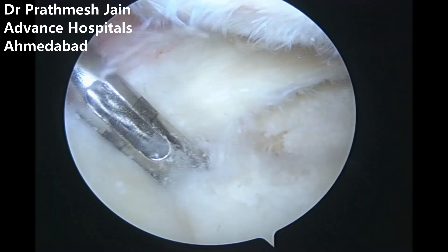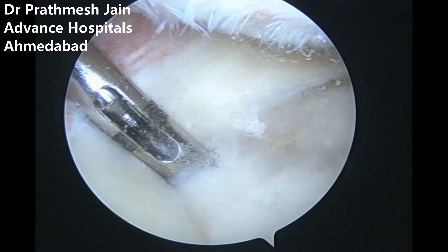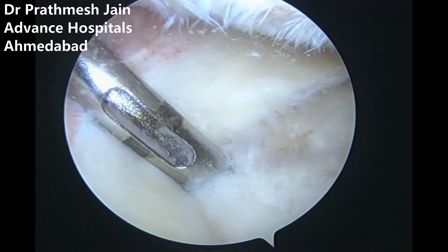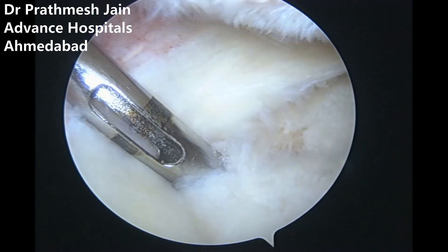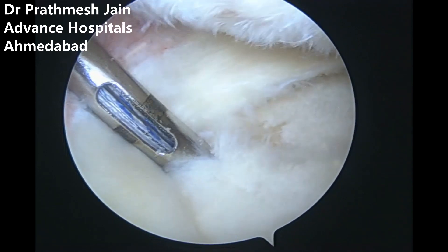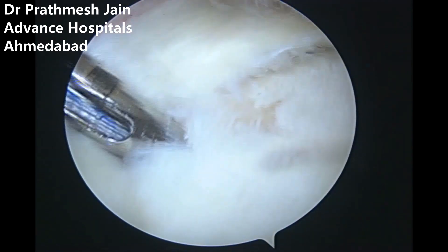We have developed a new anchor called the X-fix anchor — an extrusion repair anchor. It is an all-suture anchor with number 0 wires. This all-suture anchor goes into the tibia on the anteromedial aspect, and we usually use two of these. The first suture anchor is inserted.